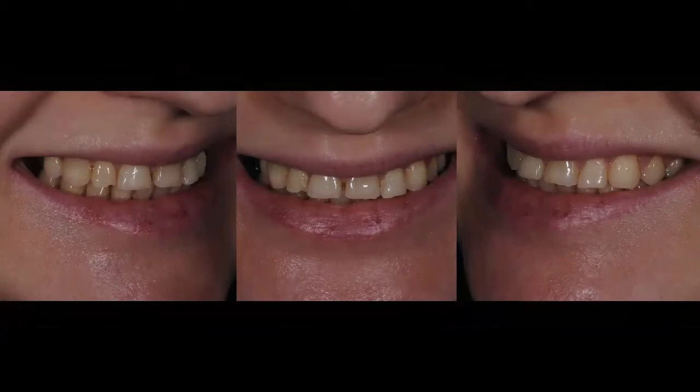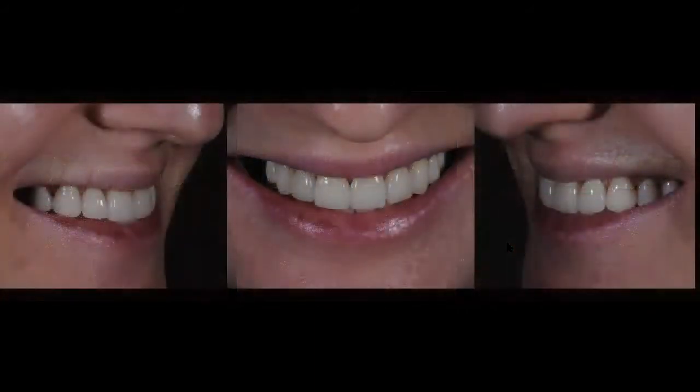Clinical crown lengthening. There was a lot done in this case before we got to the final impressions and final restorations. So by no means do I want you to think that this was an easy case that we did in a couple of sessions. This case took me maybe 8 to 10 months to complete. But what I want you to see now is the difference between the before and after.